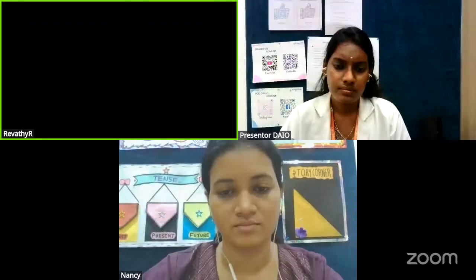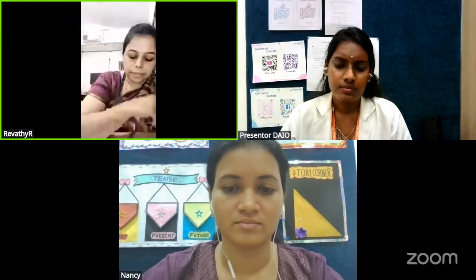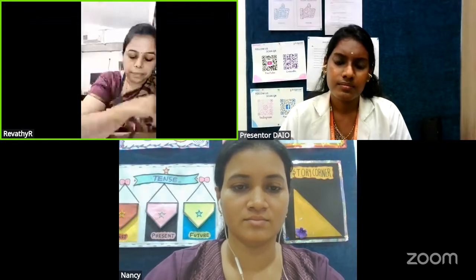So in corneal ectatic conditions, as I said, manual keratometry is not going to have much value. Mostly we will be relying on corneal topography. All the assumptions on which keratometry is built are that the cornea is spherical and the central 3 mm is measured, and these assumptions do not hold for ectatic corneas. They are for normal corneas only.